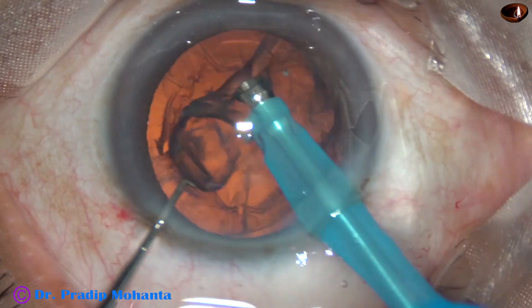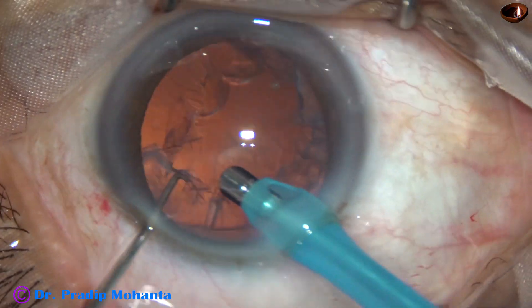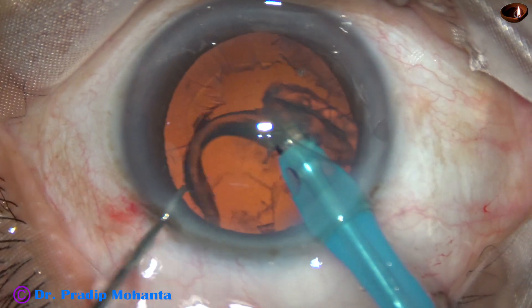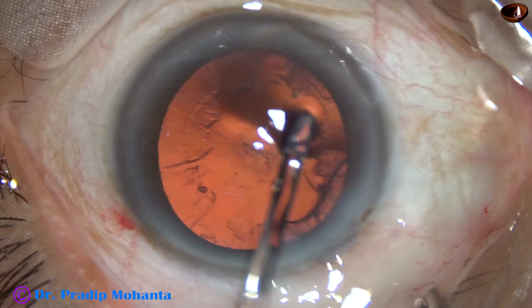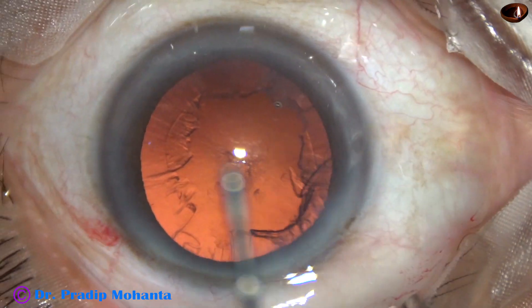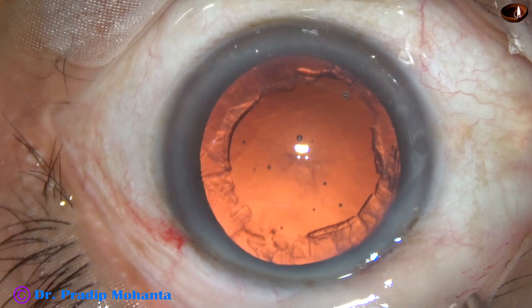Phaco power is 60% in this case. This is the epinucleus. Flow rate in this case is 45. Vacuum used is 450 millimeters of mercury. In this case, we have made only one side port.